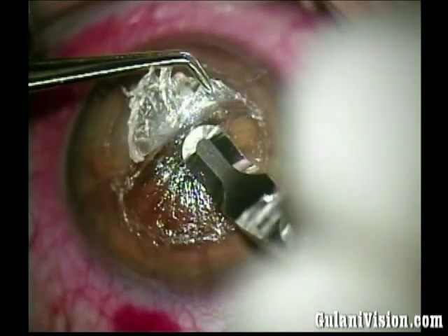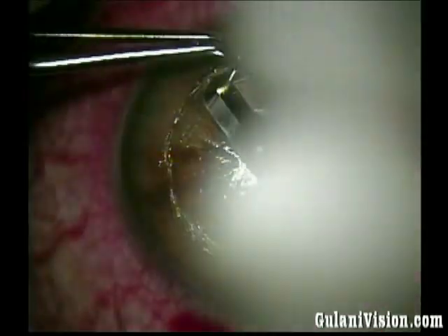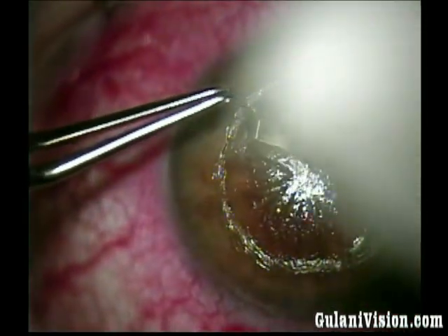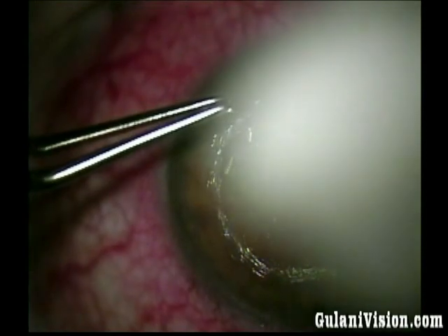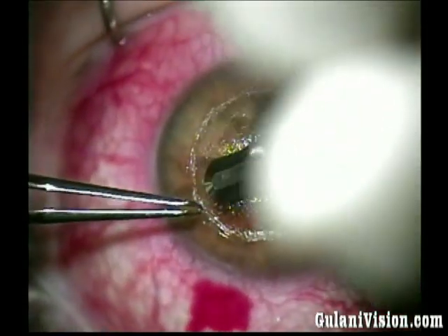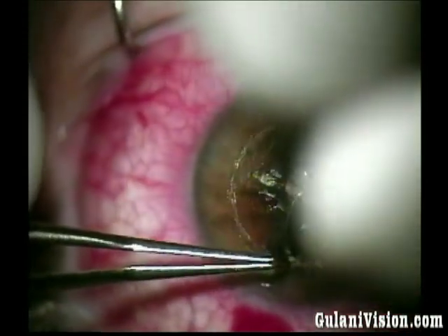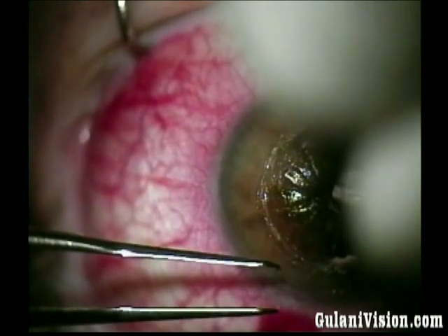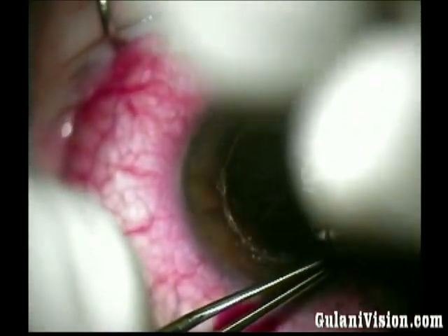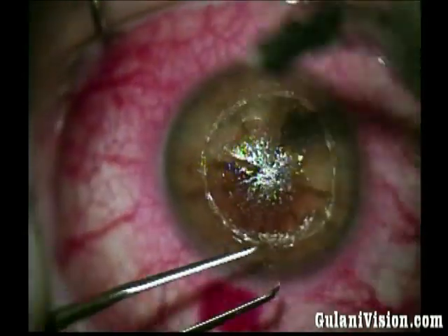Gentle and easy. These RK incisions truly look like they'll open up any minute. No wonder there was this deep scarring. I'm now preparing the peripheral pocket, again keeping all principles, no matter how difficult, for future success. At each stage you see me holding or providing resistance with my forceps. In this way I'm transferring the resistance between instruments and not on the cornea.